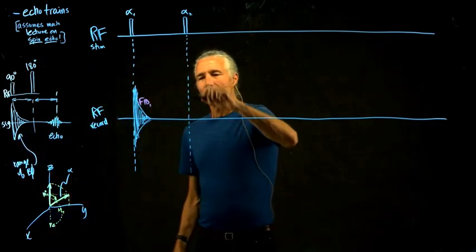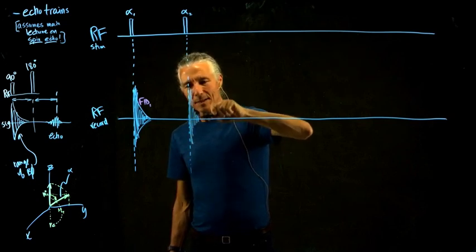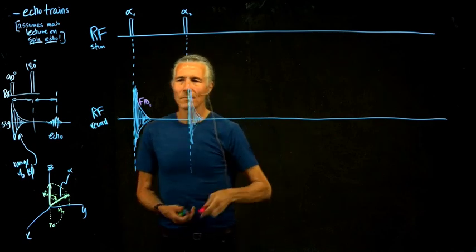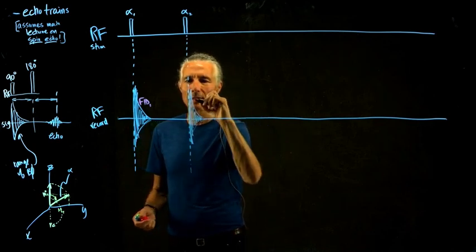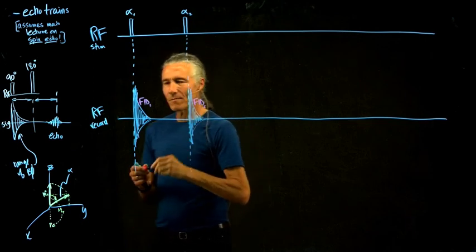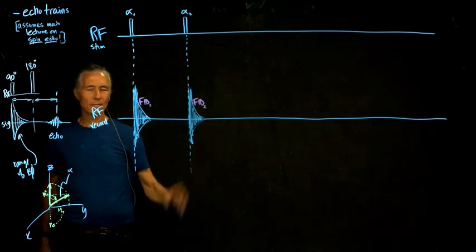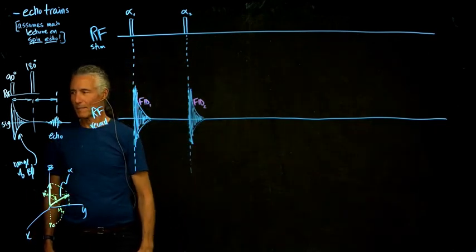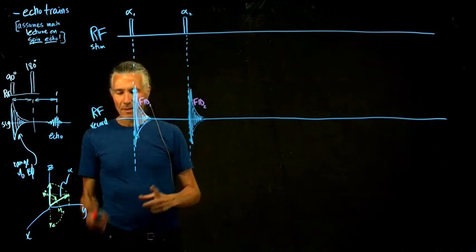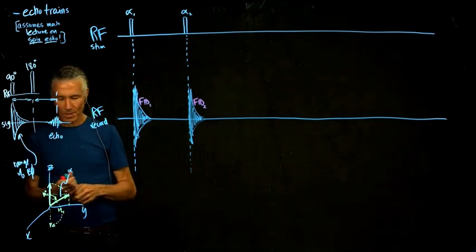What will happen from the second one is another FID. So here's another FID, T2 star, so this is FID2. If we just did FID1, nothing happens. You just do FID1, the signal just disappears, it doesn't come back. If we do the second RF pulse, now we get one echo.